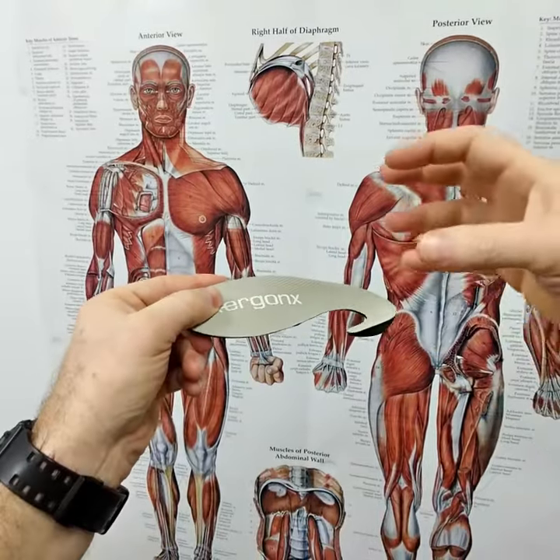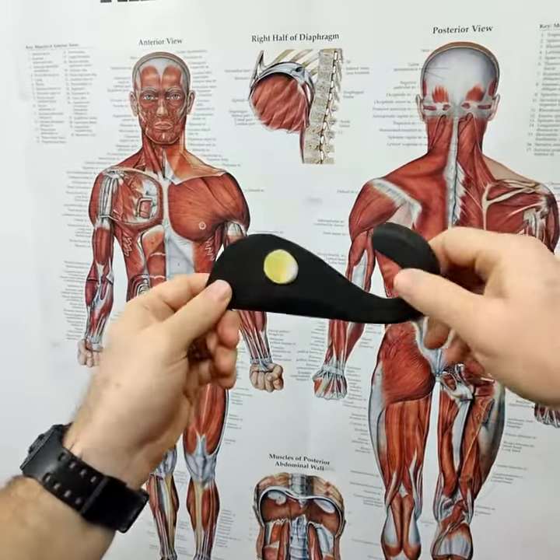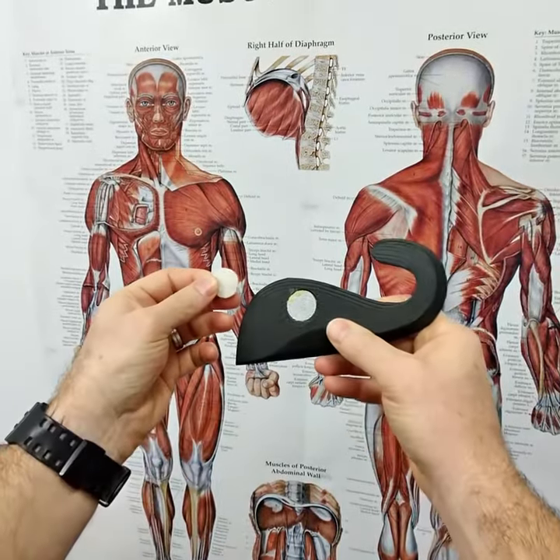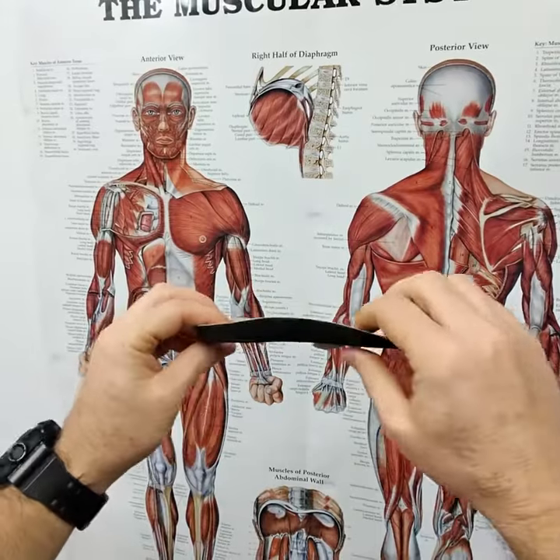It's got this deep heel cup that keeps the foot's natural fatty pad beneath the heel and helps to cushion the high impact area of the heel. And we've got this Velcro edition so it can stick firmly in the shoes. That's the Ergonx Slimline.